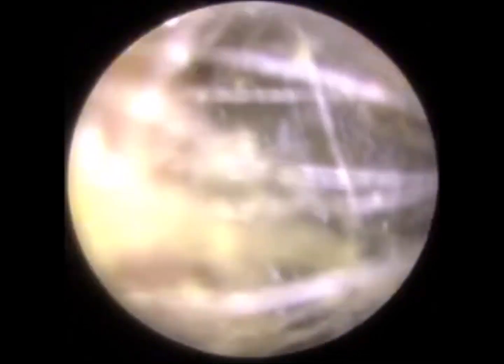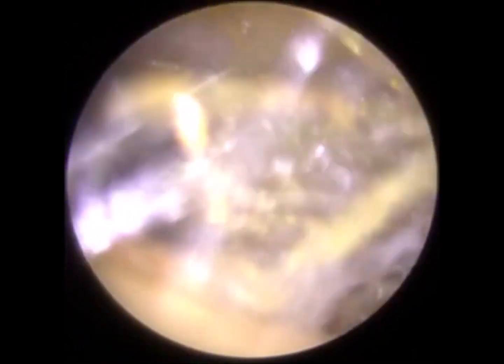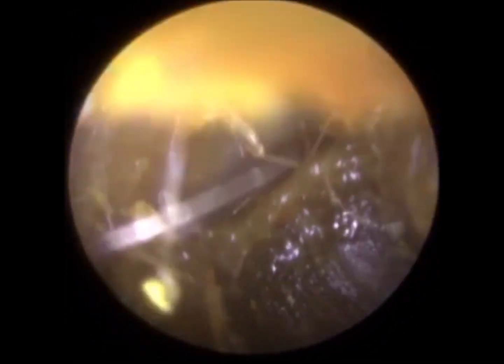I'm just trying to wriggle this out — there is some matted wax. We know we're at the entrance because there are a lot of hairs. The hair follicles, or cilia as we call them, are on the outer third of the ear canal; very rarely do you find hair follicles in the inner two-thirds, the bony part. So if you ever see loose hairs in the ear canal, you know either a cotton bud or Q-tip has been used, or the patient has been shaving their ear hairs. Now going in with the jobson horn — gliding it in along the roof of the ear canal, there's enough of a gap — and I'm slowly bringing it forward. I can see the eardrum just in the distance, and this wax is a bit firmer, so as I bring the jobson horn forward it's bringing all the wax in its entirety in one big mass out of the ear. It's quite a big piece of wax, roughly equivalent to the plug in the left side.